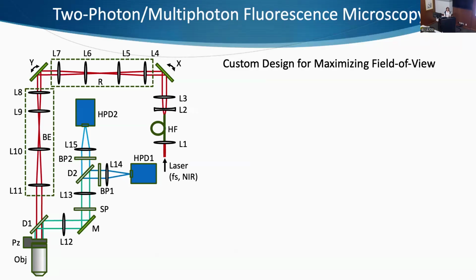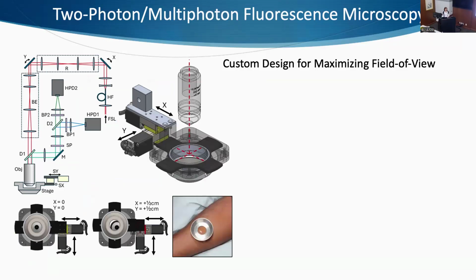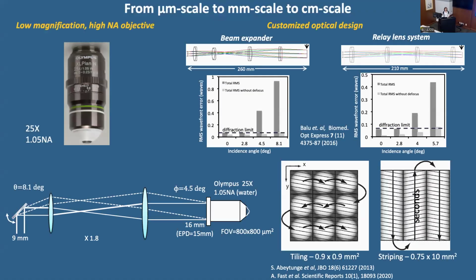The next slide. So the key issue is that you want, with the wavefront analysis, to maximize the angle by which you can have the beam entering the rear aperture so you can maximize your field of view, right? But what it's telling you is that as you have a higher wavefront error, does that mean that at the locations of the image where you're using the edges of each frame, you have a slight degradation of your resolution because your wavefront error is slightly higher? Yes. Okay. Yeah.